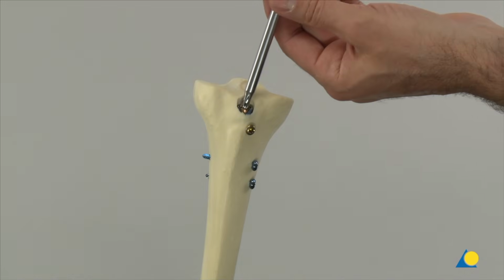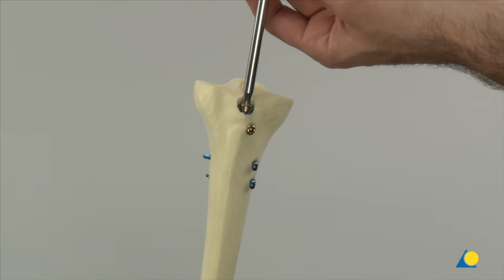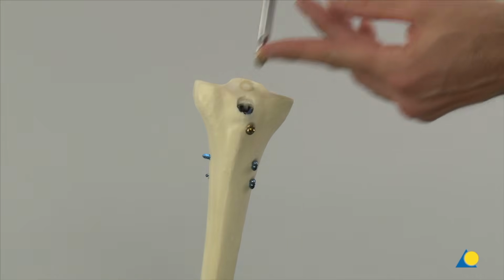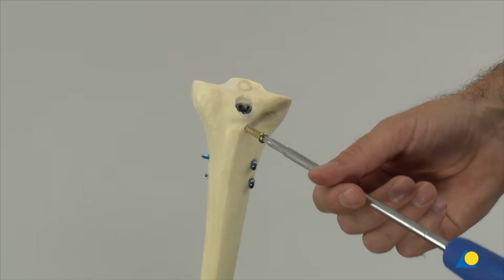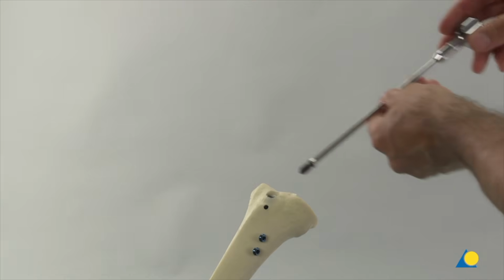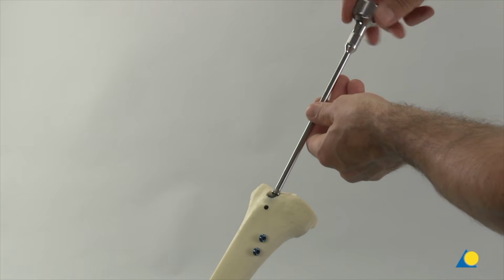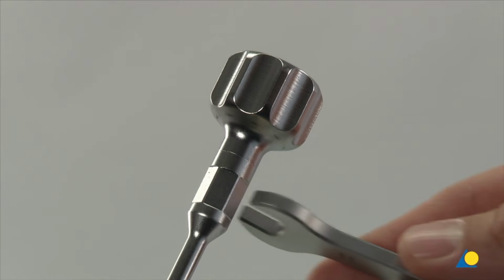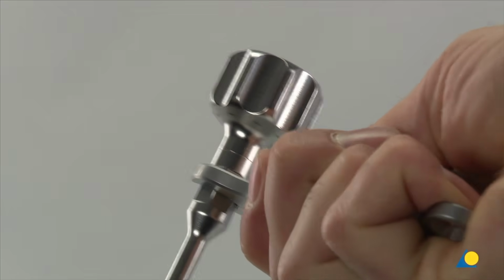The T40 star drive screwdriver is threaded into the end cap, and the end cap is removed with counterclockwise turns. The cancellous bone locking screw is removed with the T25 star drive screwdriver. To prevent rotation of the nail or displacement posteriorly, the extraction screw is threaded into the nail and tightened with the combination wrench prior to the removal of the locking screws.